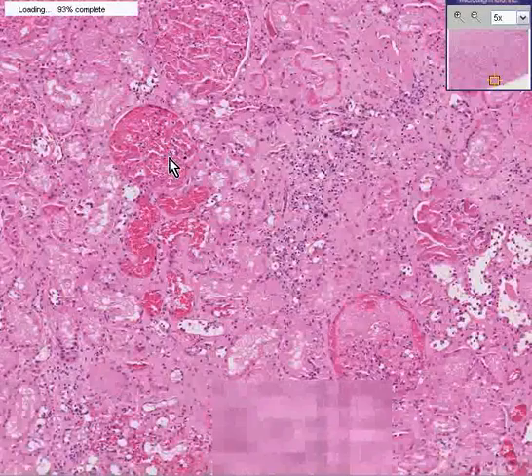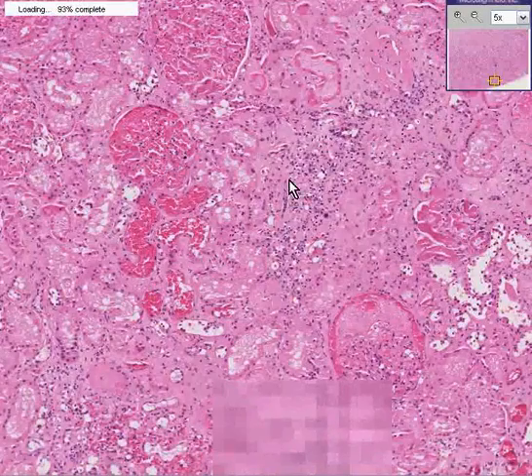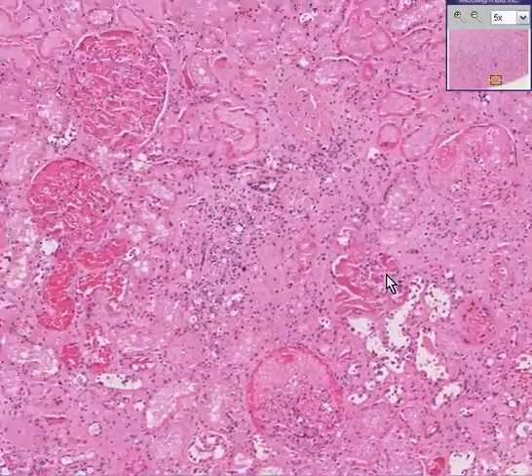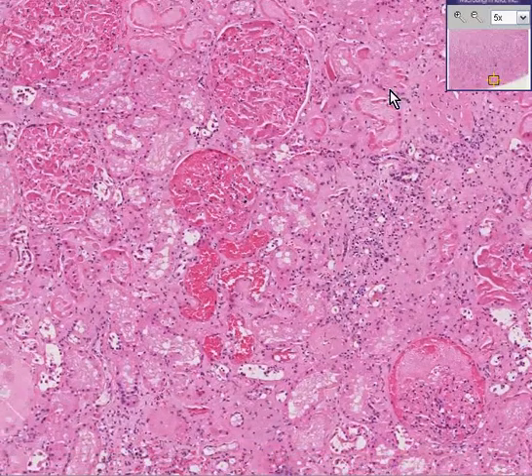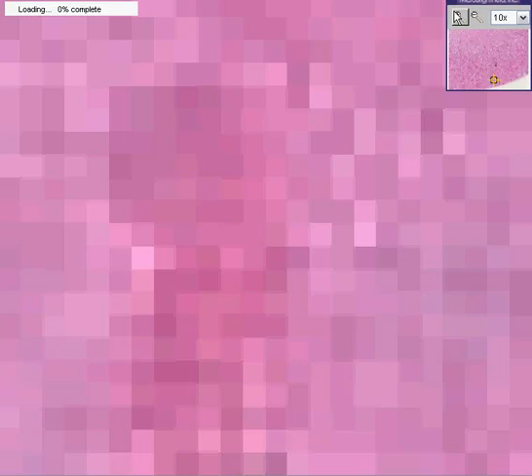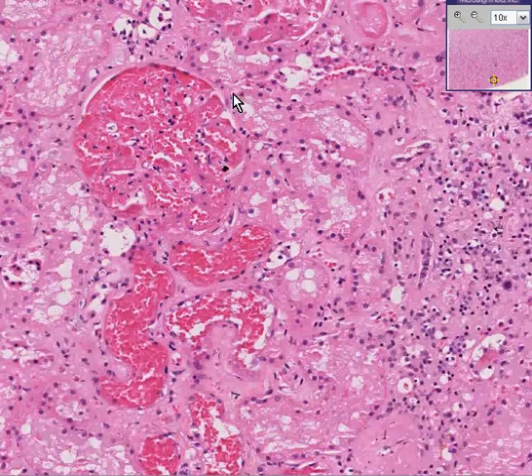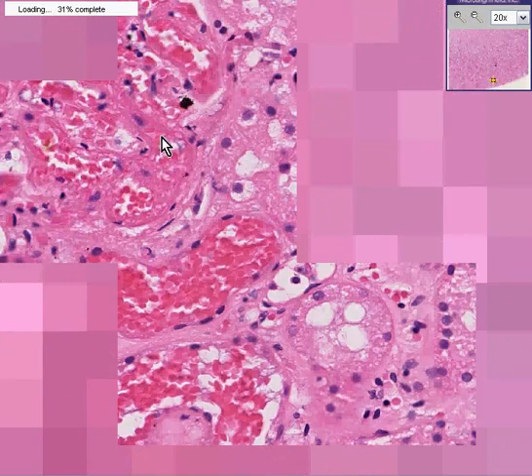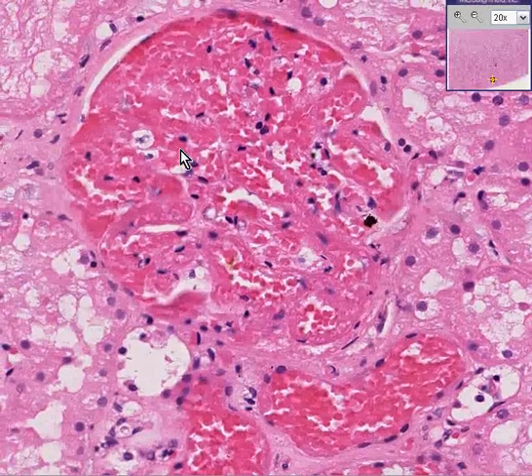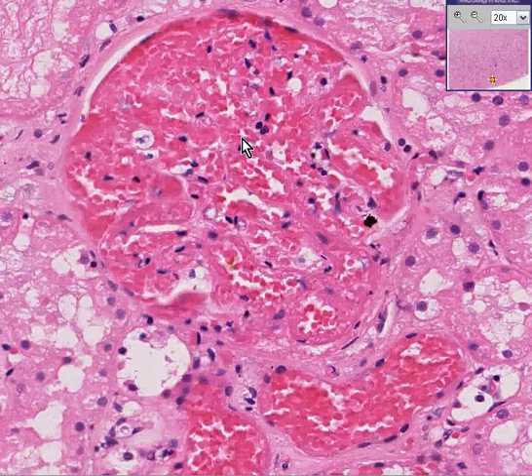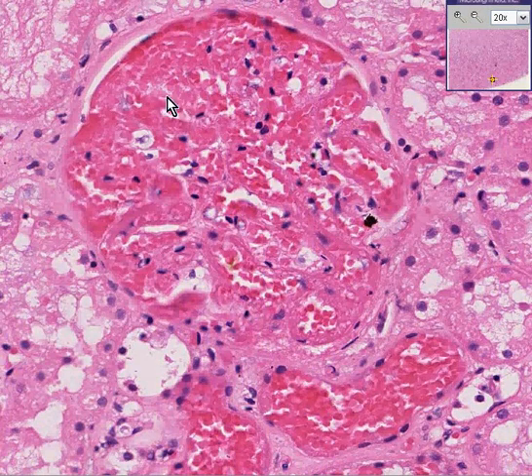And why do you think that might be? Let's zoom in on one of the glomeruli. You'll notice that not only does it seem to be very much congested, but it seems like the glomerular vessels are also filled with some granular red material as well.